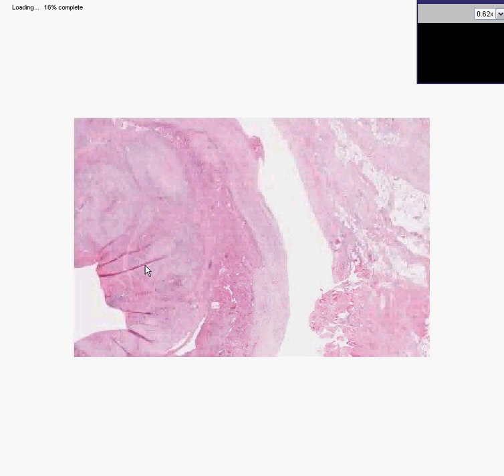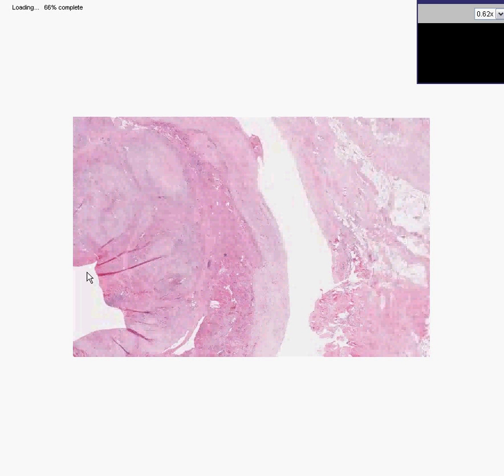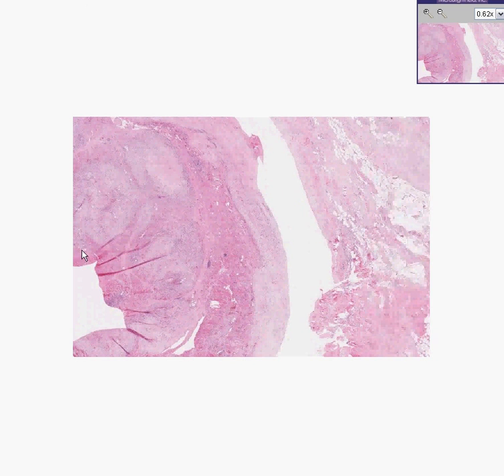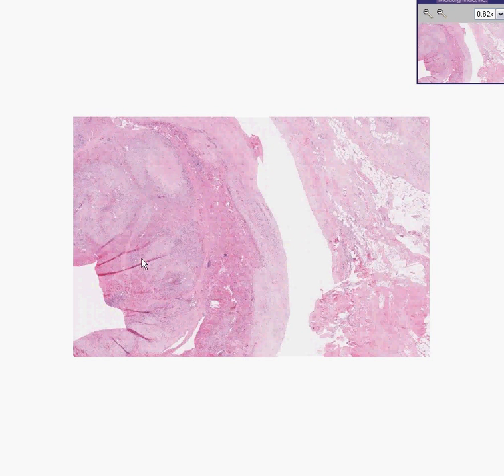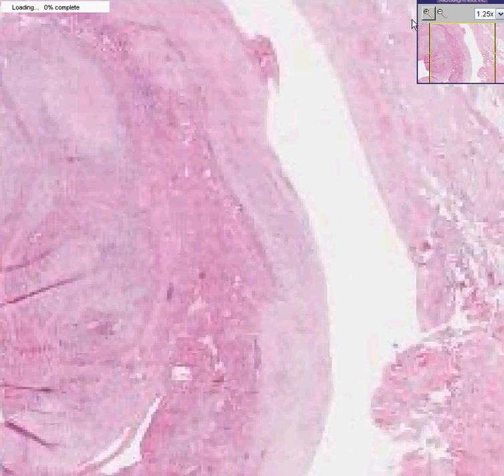Here is the mucosa, or what's left of the mucosa — I really don't see much there. This looks like an extensively infiltrated submucosa. This looks like there's a lot of disrupted smooth muscle fibers of the wall. And this is a diffusely fibrotic serosa. This is the world's best, most classic microscopic picture of a linitis plastica.